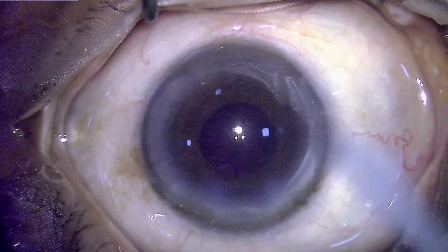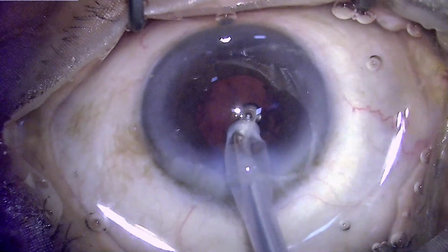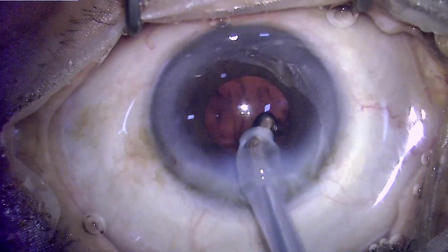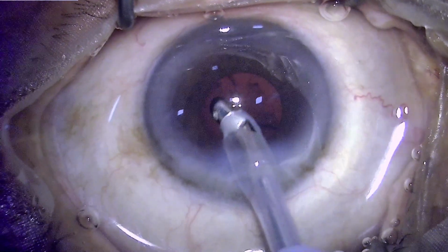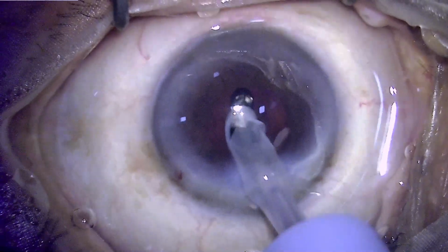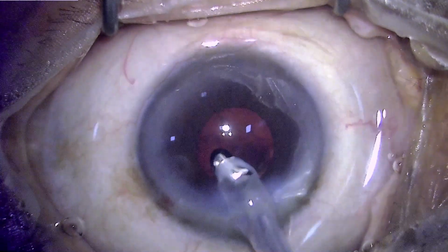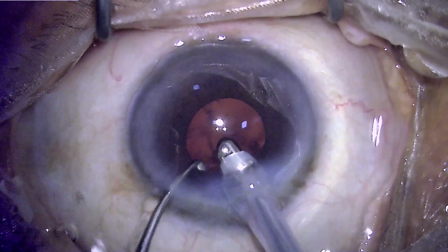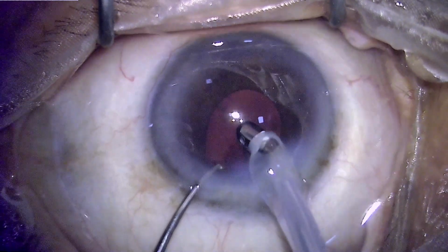Once the emulsification has been done, we can see the pupil is small, something like 2.5 to 3 mm in size. Removing the cortex becomes a little tricky because the cortical fibers which end at the rhexis border are hidden here. So one has to be very vigilant, and at the same time remove all of the cortex. One can always use a hook or a chopper to pull back the iris tissue so as to peek underneath and see if there is any retained cortex.